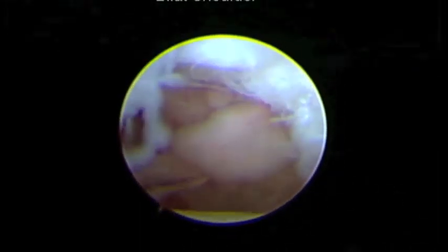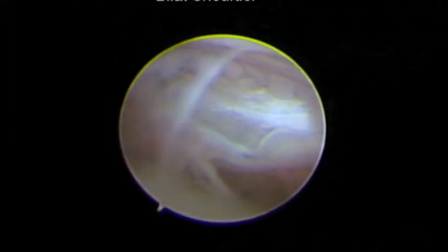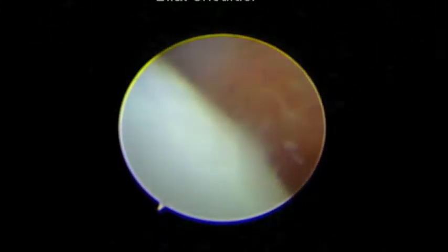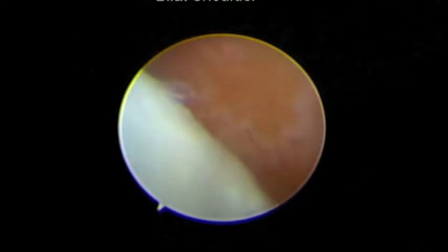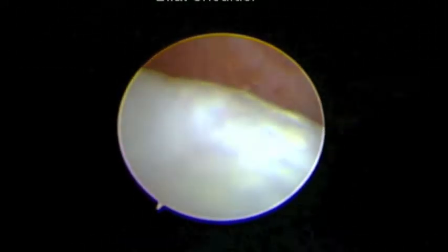Now we're coming to the joint capsule, which doesn't look like a capsule. It should look like a smooth, kind of distended rubber band or rubber balloon. You can see this severe, severe inflammation in the back portion of the joint. Look at the cartilage on the round surface — that's the humeral head. It's all fibrillated, like craters on the moon. It's all deteriorated, probably from chronic wear and tear as well as micro instability from medial shoulder syndrome.